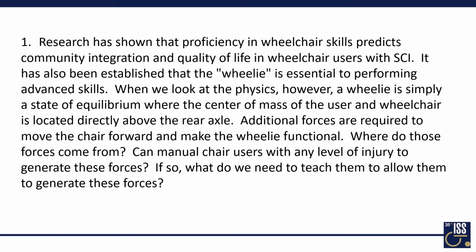I guess just one other thing is that if I lived in Pittsburgh, I would probably move my axle backward a little bit to make my chair a little bit more front stable, because I'm on smooth level surfaces, and there's not a lot of those around here, except for this lovely convention center with this wonderful carpet that I just can't get over how little resistance it has when you roll over it. I'm used to the Gaylord, and I can even do my little semicircular stroke around here and not have to do my little pop and carry motion to keep my casters rolling. But I digress.